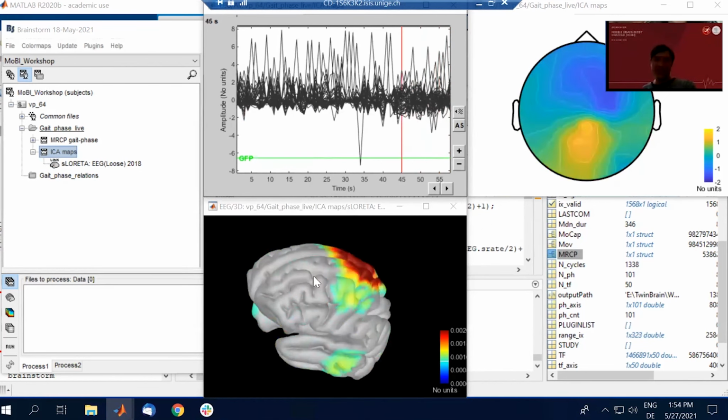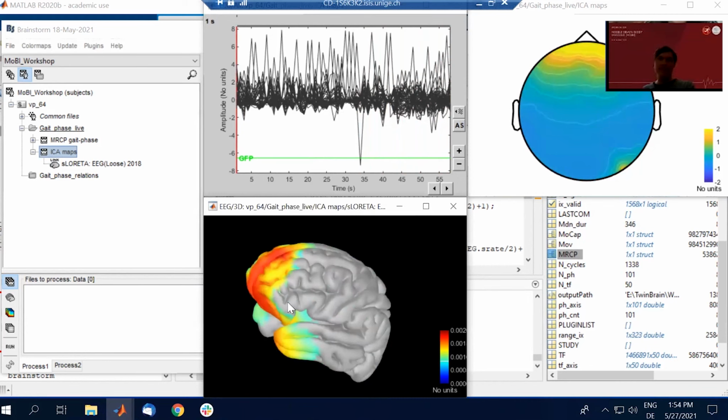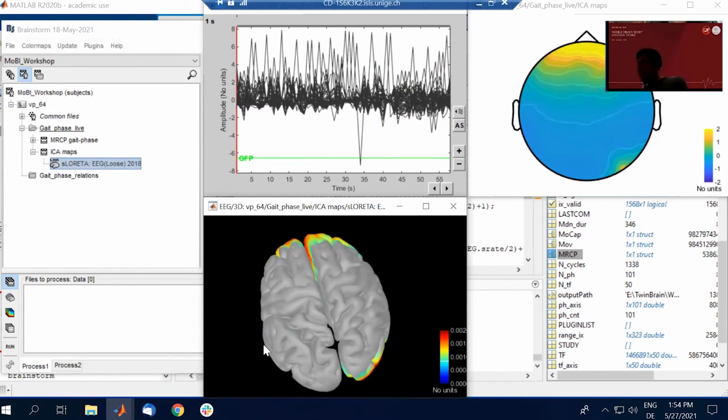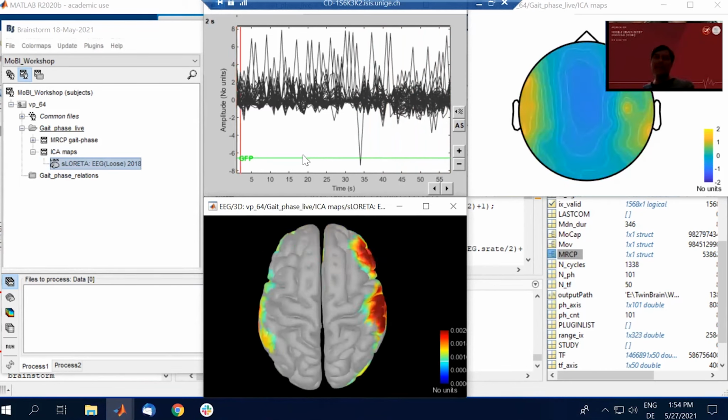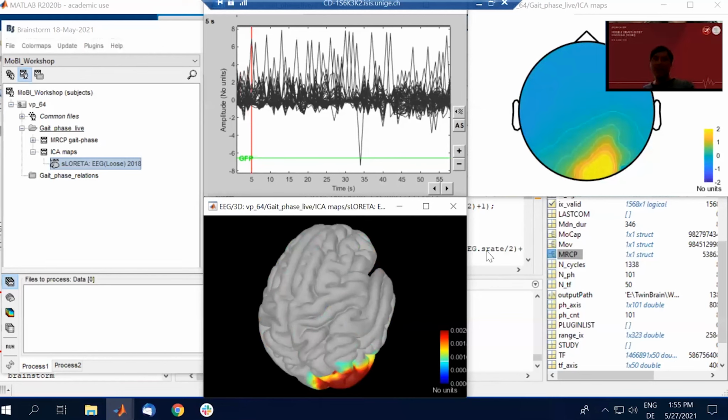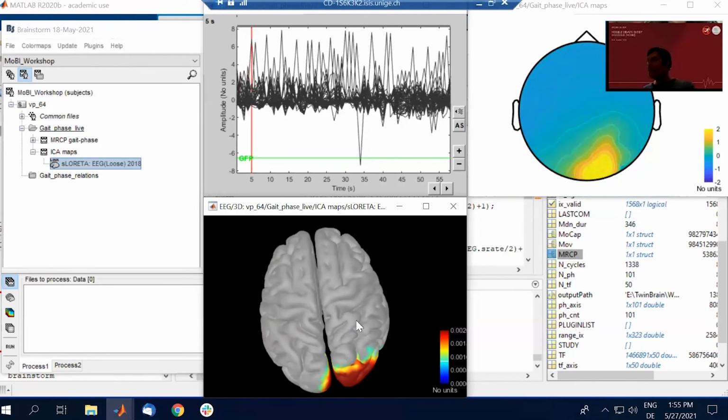So what I want to question is, because you always have a blob in the brain, you not always should say, okay, this is now olfactory activity, some kind of prefrontal ones. But you always get some source imaging result. You have to assess if this makes sense, if this is plausible. But what is nice, in addition to dipolar analysis, in cases you not only know that you have one dipole, especially in artifacts, you have some kind of source representation of your IC patterns that just come right away, right? This is just, I think, a very nice representation. And I think for that, I gave you a rough idea how to do that.